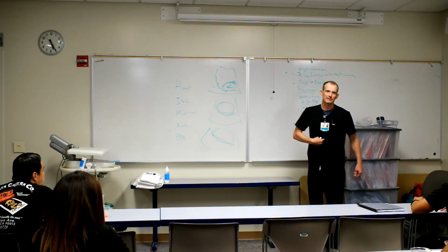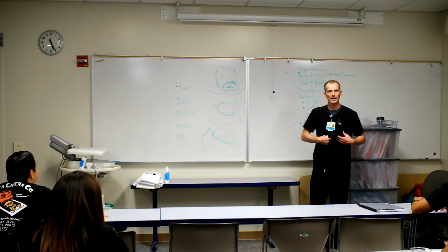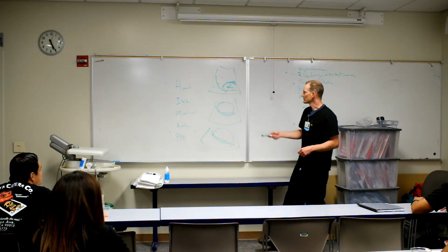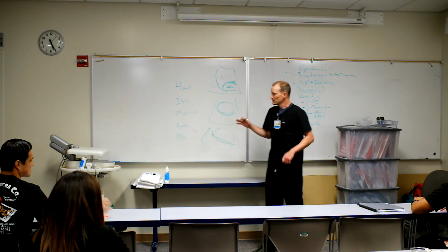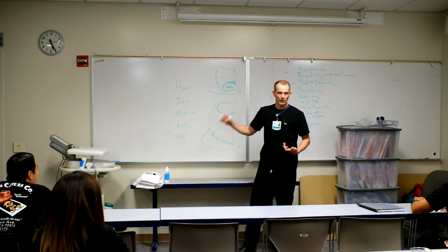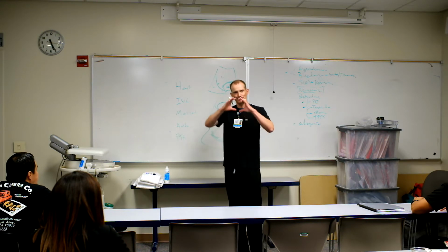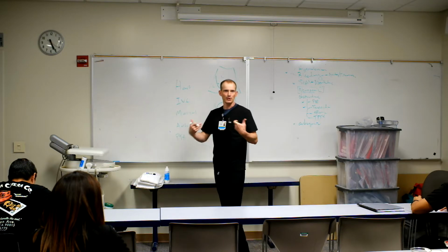So you just have to sit there and push and wait for the bowel to peristalse out of the way, and then once it gets out of the way, you see the aorta. So the time that's going to be important is when you have someone who didn't have a previous aortic aneurysm, but they do have a dissection. Okay, but if you put the probe on there and you see this big fat aorta, you should be thinking, hey, this thing probably ruptured and it's leaking.